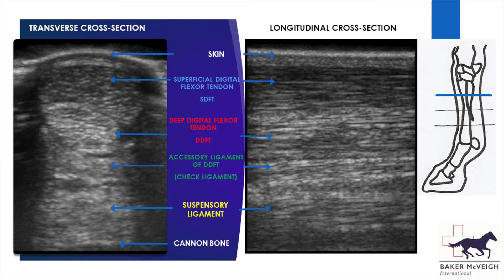The tendon of the superficial digital flexor muscle is closest to the skin on the back of the leg, and you can see it here slightly wrapping around the tendon of the deep digital flexor muscle that lies underneath it. Next comes the accessory ligament of the deep digital flexor tendon, which is a short ligament running from the back of the knee, merging with the deep digital flexor tendon about halfway down the cannon region.